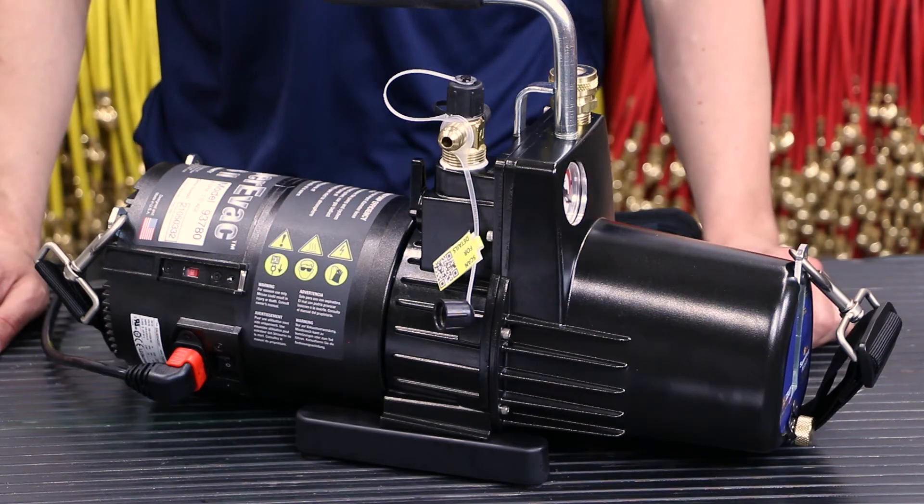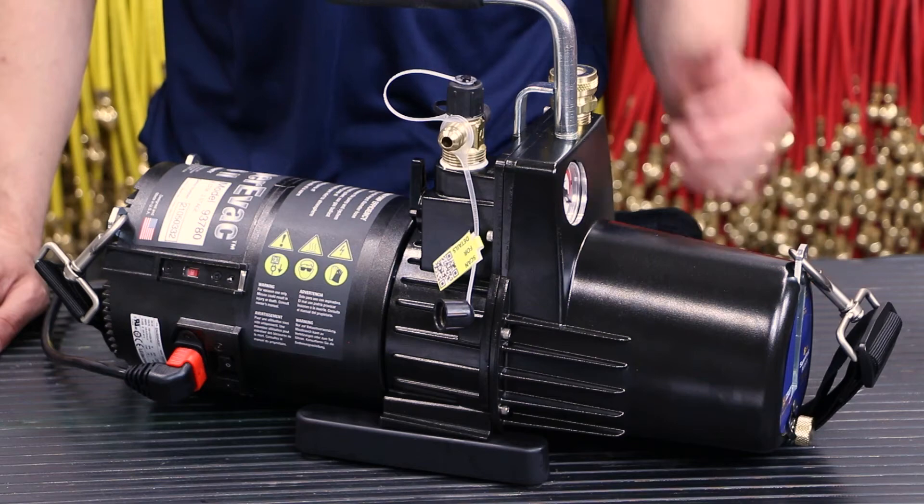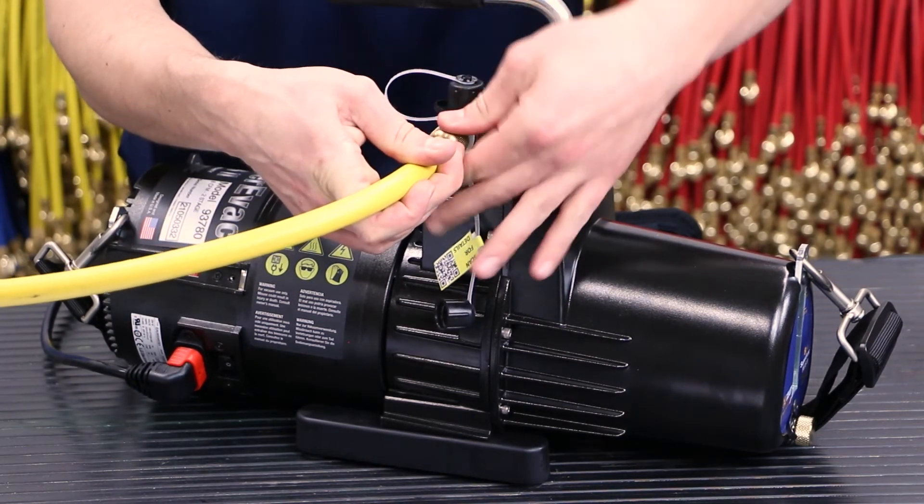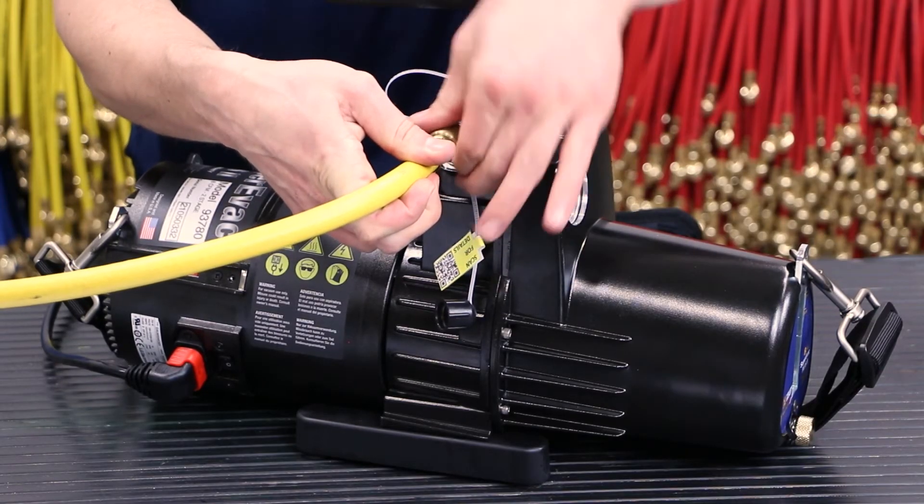When the voltage is set higher than the actual input voltage, the motor isn't getting enough power. It will run slow with a different tone from the exhaust, and when a load is applied — such as hooking up a hose or pumping down a system — it will stall out and reset, trying to start again.